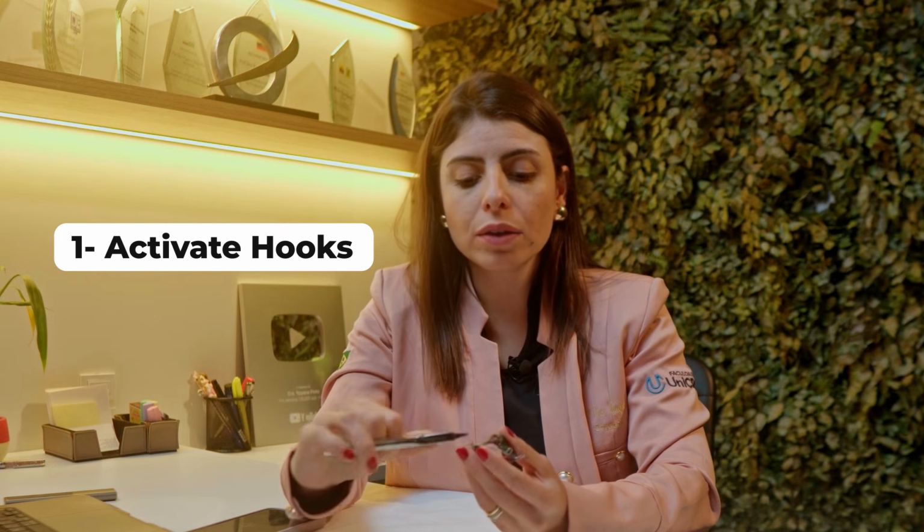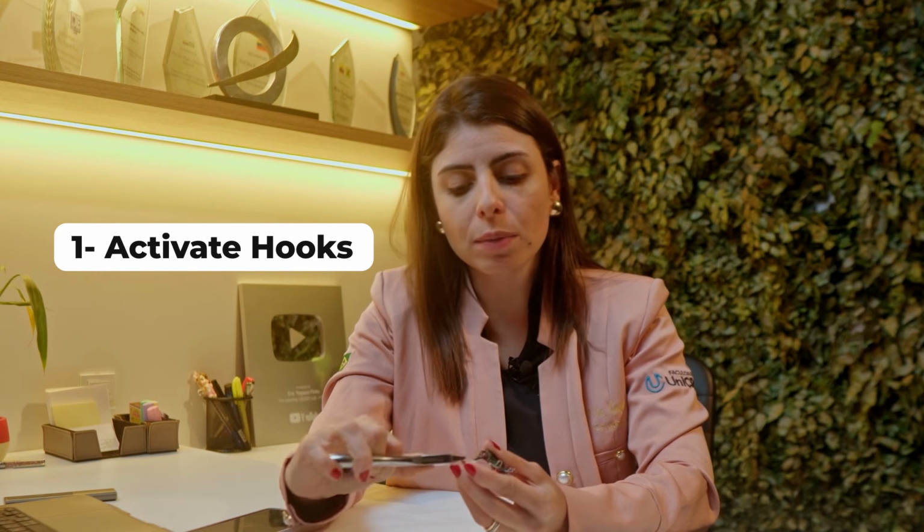So what do I do during a checkup for an Andresen activator? I activate the clasps, number 1. So I take my bird beak pliers. I can close the activation omega of the vestibular arch.